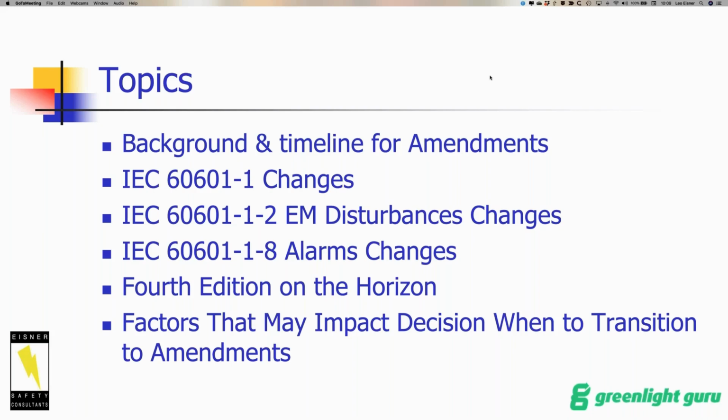So that's not too bad, but there's definitely a percentage of people out there or companies that didn't know about the amendments, which isn't terribly surprising because standards keep changing very quickly, is what I see. So my suggestion, which is always, is you need to strategize and plan. And so one thing I suggest is getting copies of the standards and looking at the impact to your company and doing a gap assessment, how that's going to impact your company.